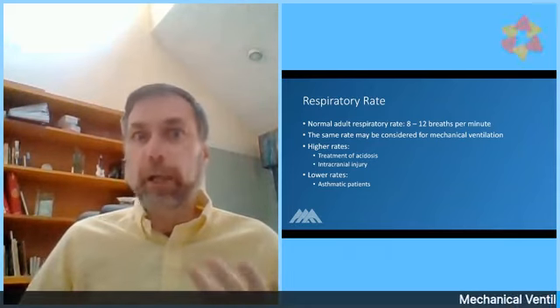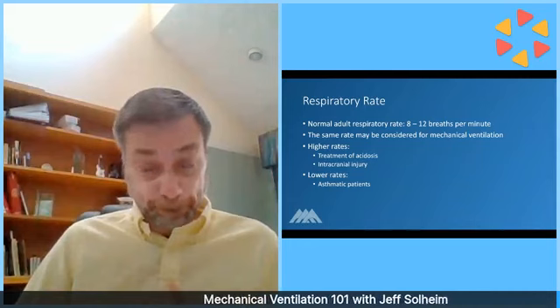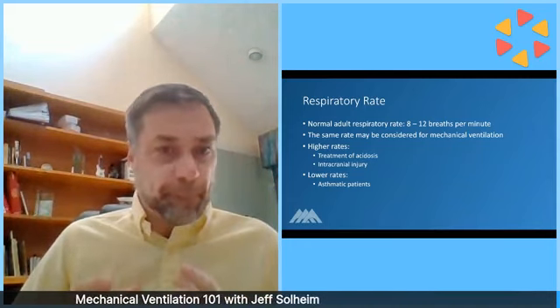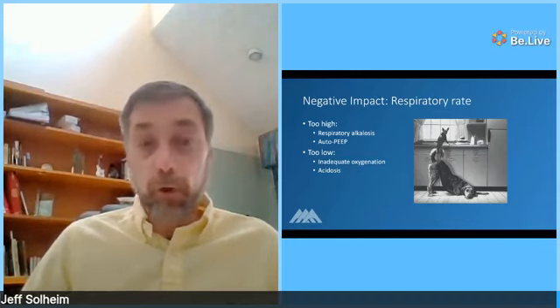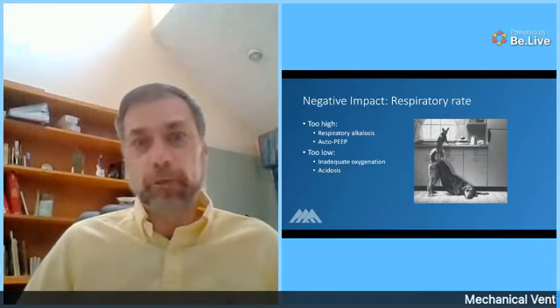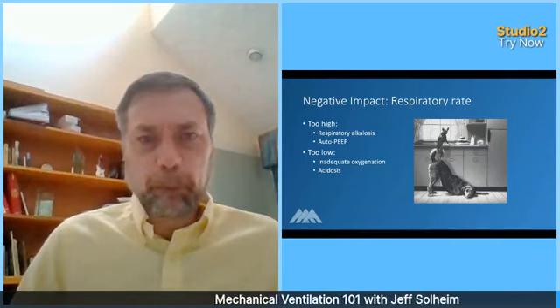So we may use a higher rate, but you just have to be very, very careful because as time goes on, they're going to have a lot of debris in the airways, and that debris can cause a longer exhalation phase. If we give the respiratory rate too high, and they can't exhale enough, you can end up causing a lot of alveolar distension or high pressures on the ventilator. Okay, so let's advance the slide again.